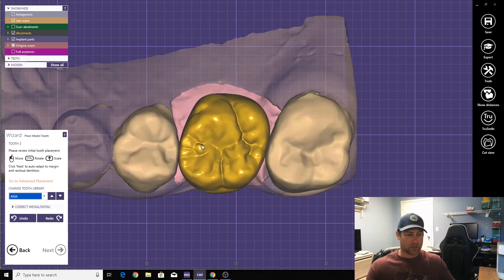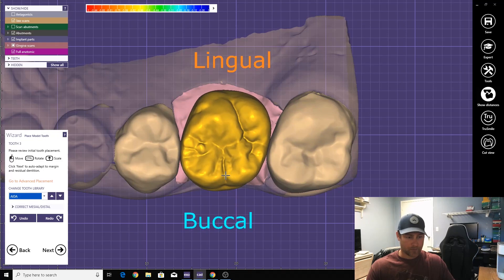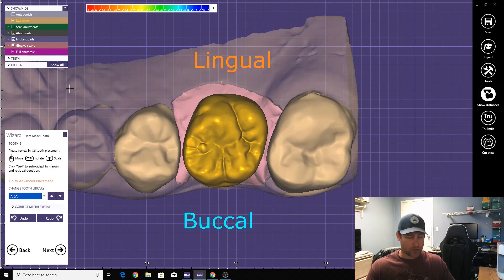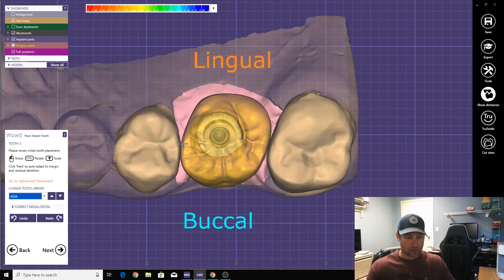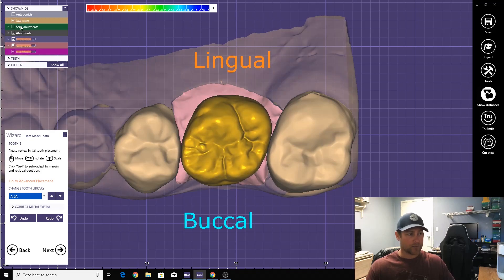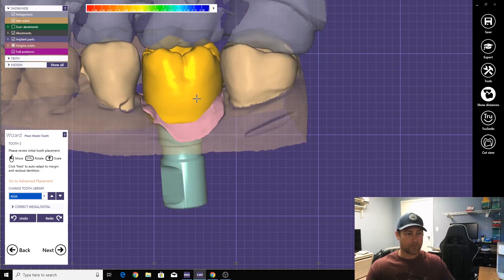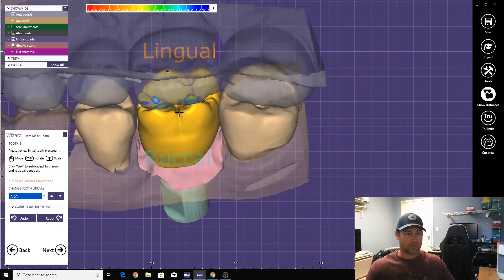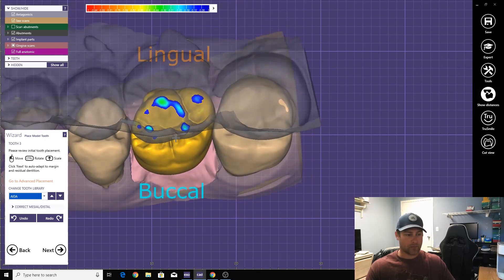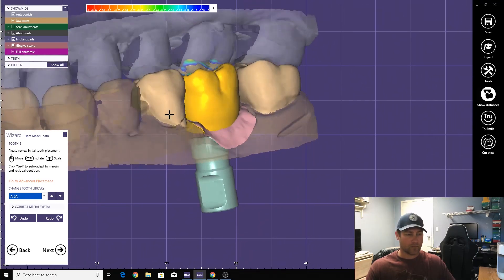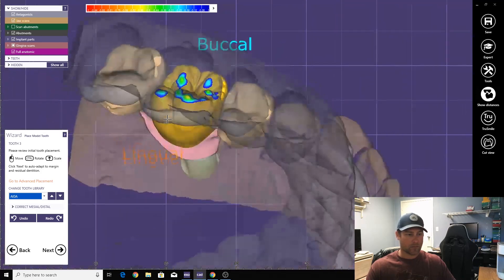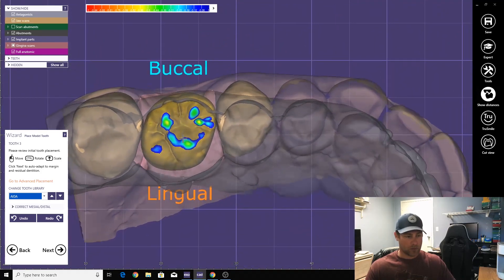So let's place the tooth exactly where we want. Keep in mind where the implant is. It's always going to be a little bit smaller around.